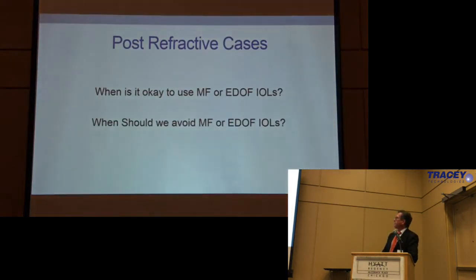So now we get to our post-refractive patients. For many years, I was really scared about using multifocals and extended depth of focus lenses in my patients that were post-LASIK, because I didn't have the tools to really understand. Just from having topography, you really can't tell the whole story. And we would have patients when we tried putting multifocals in our post-LASIK patients, and definitely not in the post-RK patients. I'll show you why.